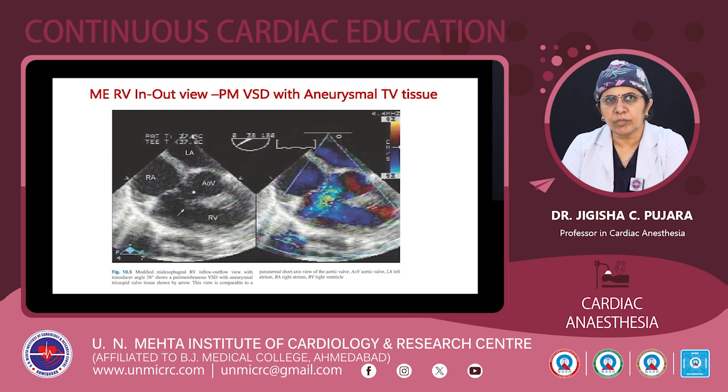This image shows the mid-esophageal RV inflow-outflow view with the aneurysmal tricuspid tissue. Here the asterisk shows the perimembranous VSD and you can nicely see the color flow.